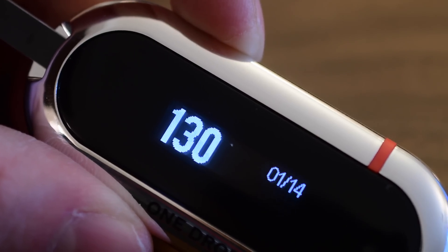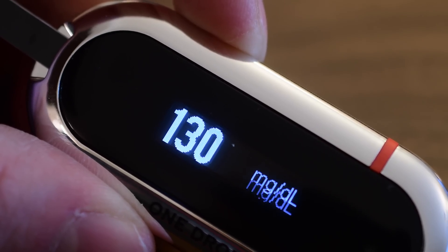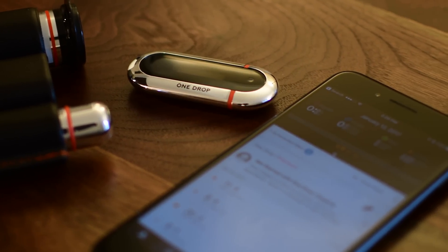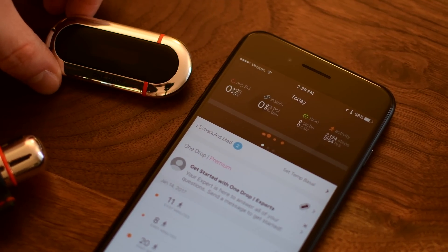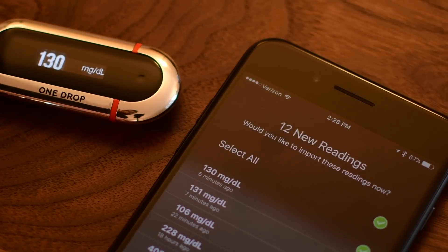Testing your blood works like pretty much any other meter out there. Prick your finger, put enough blood on the strip — it'll beep once it has the proper amount — and a few seconds later it'll give you your reading. What's really nice is that it will all store in the meter, but it will also store on your phone. It'll connect using Bluetooth and transfer everything into an encrypted One Drop app, even syncing with the Health app if you are on iOS.